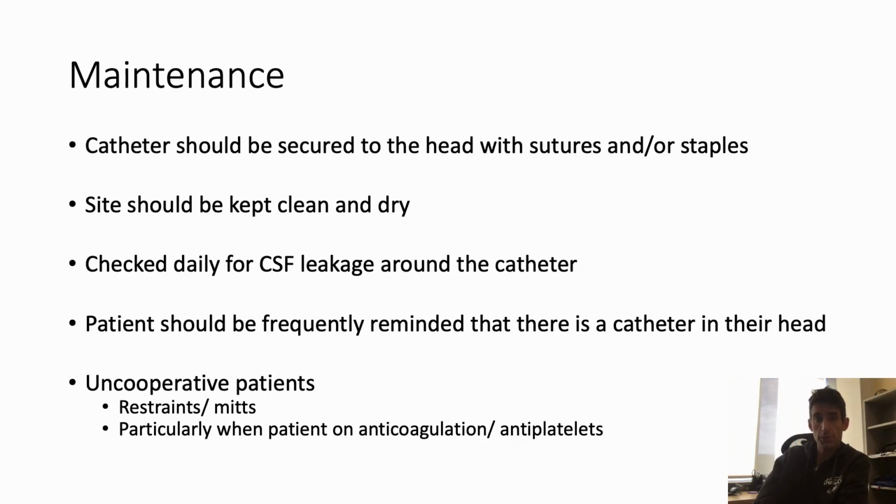So the catheter should be secured to the head. You want to keep the site clean and dry. You want to check it on a daily basis to make sure it's not leaking. You want to look at the pillow, make sure that there's not fluid building up on the pillow. Sometimes you see that. You want to remind the patient that there's a catheter in their head. And if the patient's uncooperative and they need to be restrained in mitts, I think that's okay, particularly in patients on blood thinners. You don't want that catheter coming out. You don't want to have to put a new catheter in.